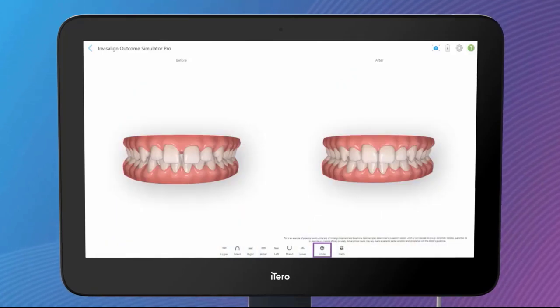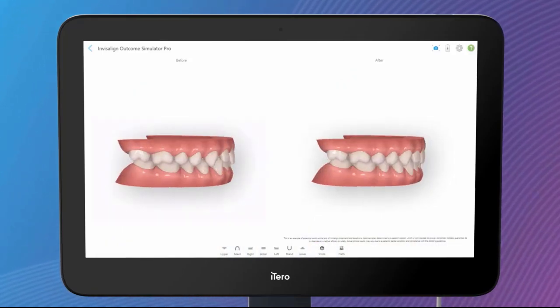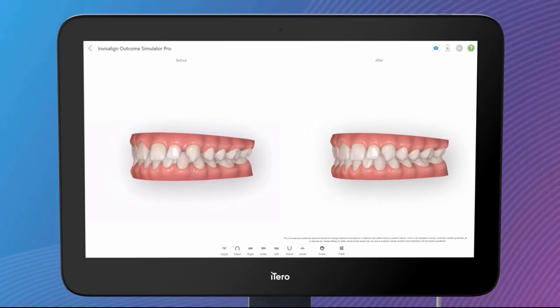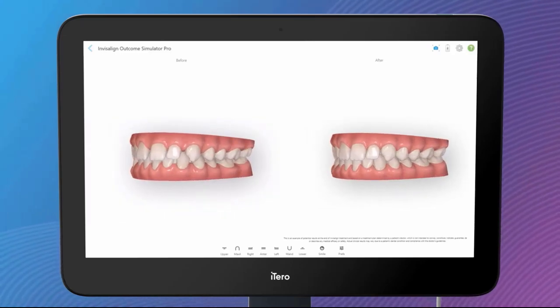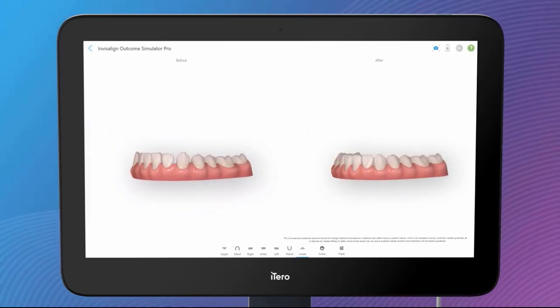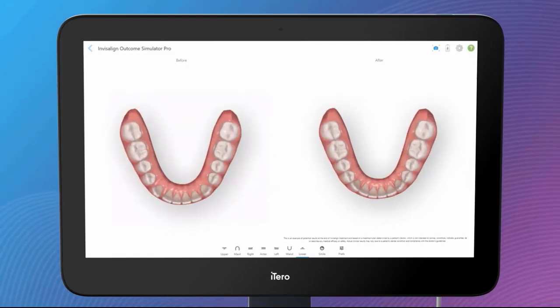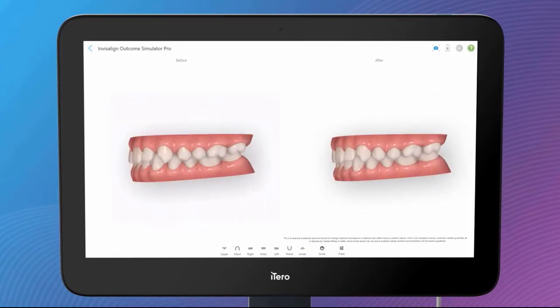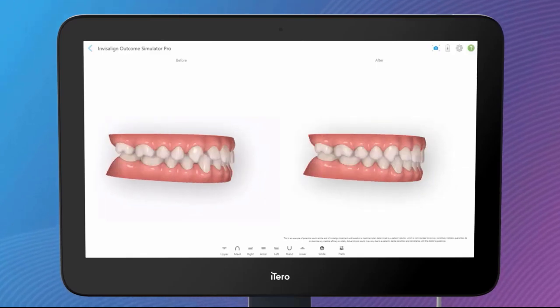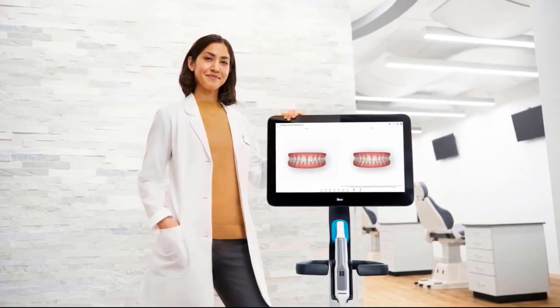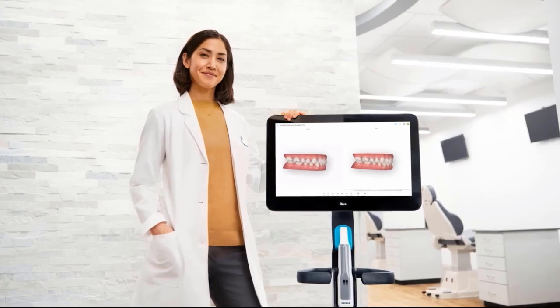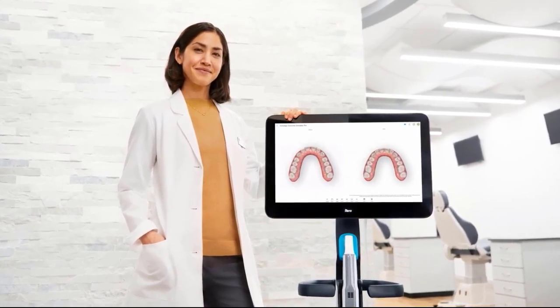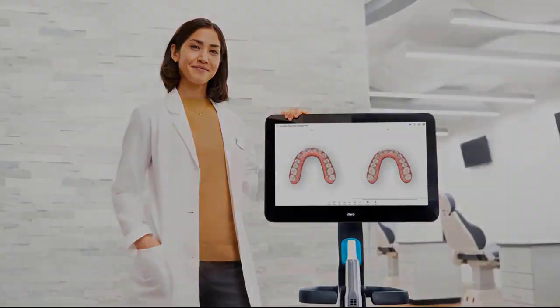The 3D Model View shows the current dentition before treatment and the simulated results of an Invisalign treatment. The toolbar allows you to zoom, rotate, and view the model from various preset angles, as well as adjust simulation settings and photo preferences. Now you can share more realistic simulations with your patients by following these four easy steps with Invisalign Outcome Simulator Pro.